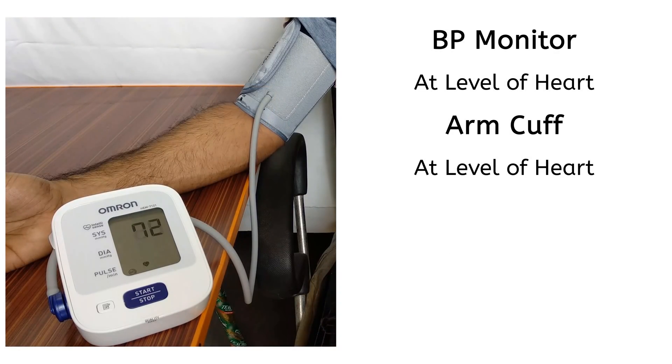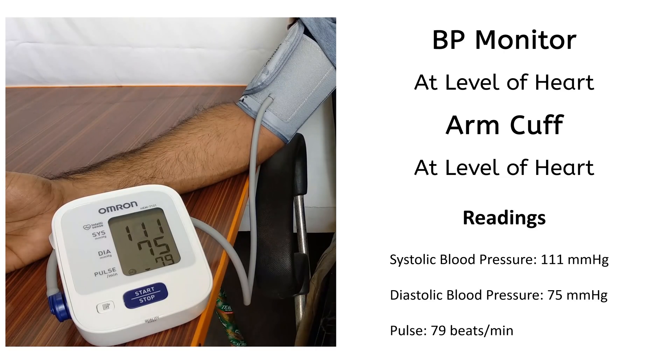This position is with both BP monitor and arm cuff at the level of heart. These are the readings on the monitor.